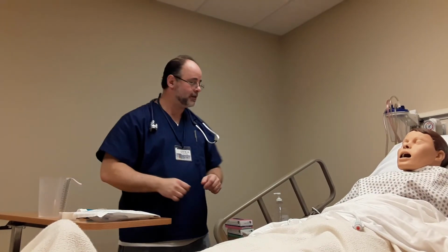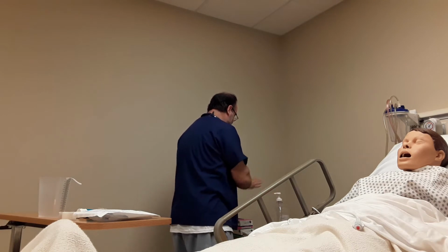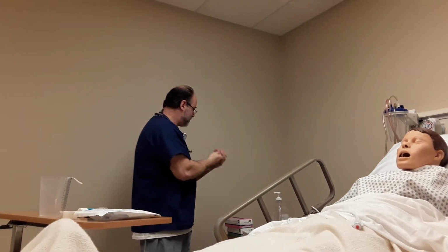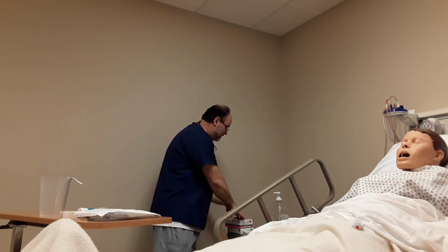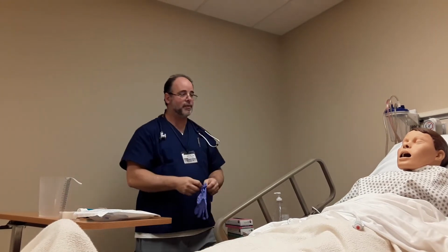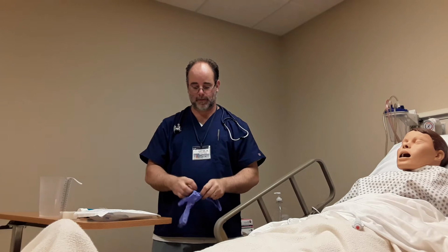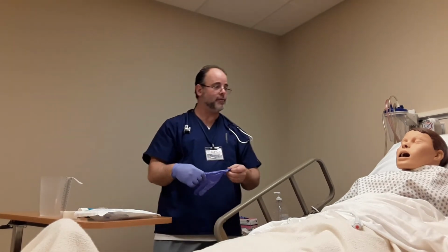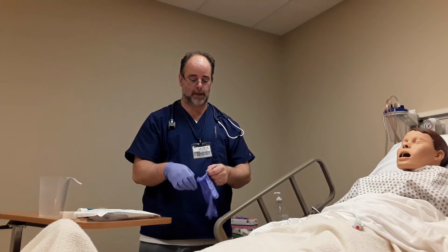Okay, so I will wash hands. I will put on clean gloves. Clean gloves are all that is needed for this procedure. It is not a sterile procedure, and students are also expected. How are we doing, Mr. Green? Okay? He indicates that things are fine.